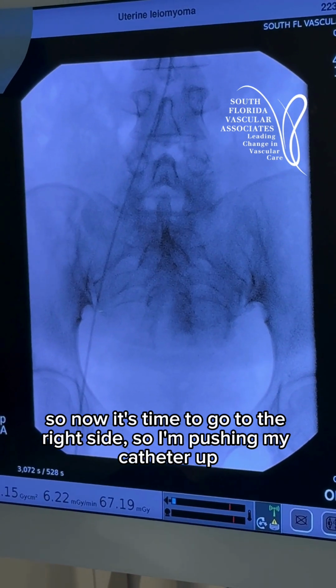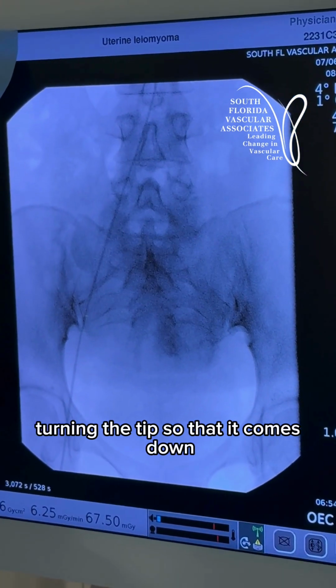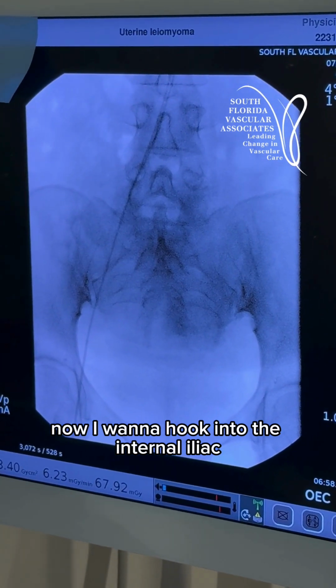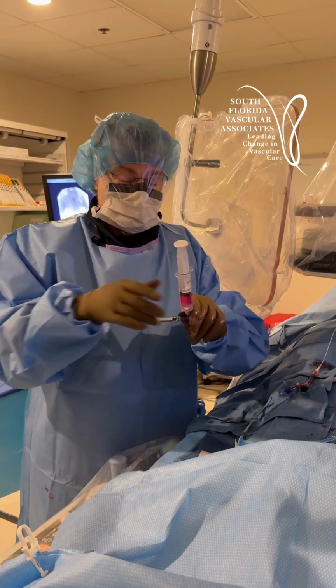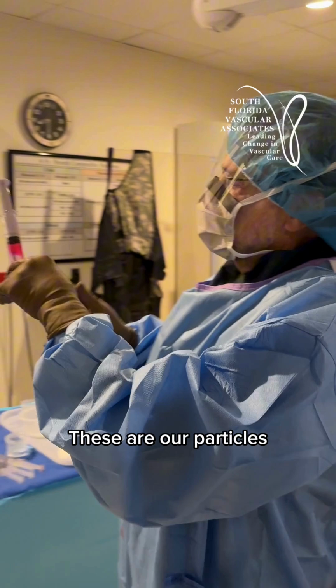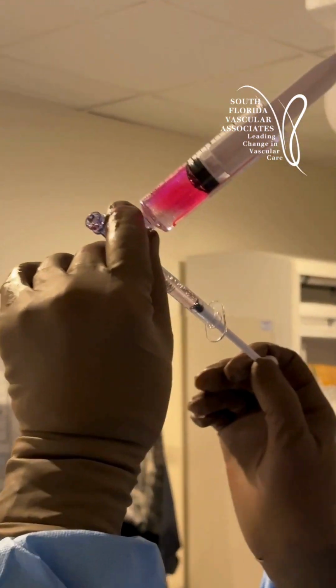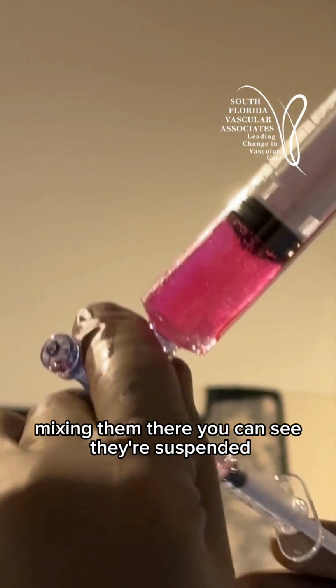So I'm pushing my catheter up, turning the tip so that it comes down. Now I want to hook into the internal iliac. These are our particles. You can see them mixing there. You can see they're suspended.